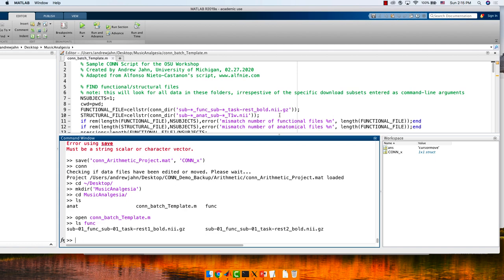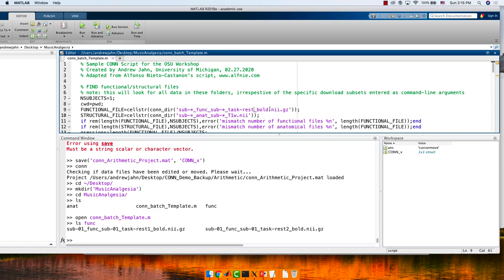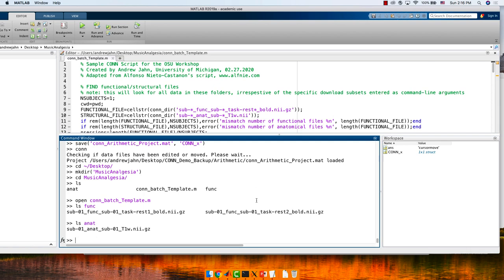There's one difference — after 'rest' in this string for the functional file, put an asterisk, because there are multiple run indexes. For the anatomical file, this should work as-is. That's the only change we need to make. And the TR was three, if I remember correctly.